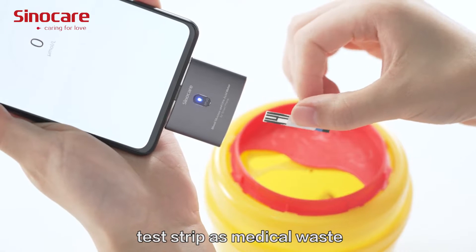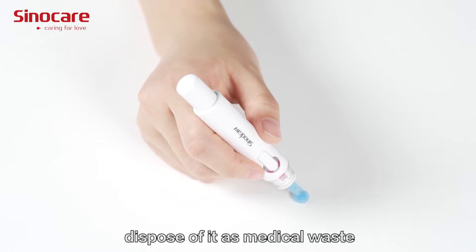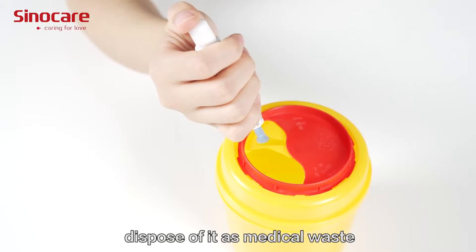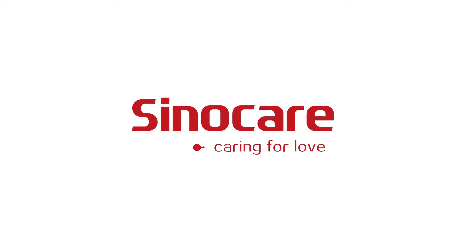Please dispose of the test strip as medical waste. Insert the needle into the cap and dispose of it as medical waste. SinoCare — care for love. Thank you.